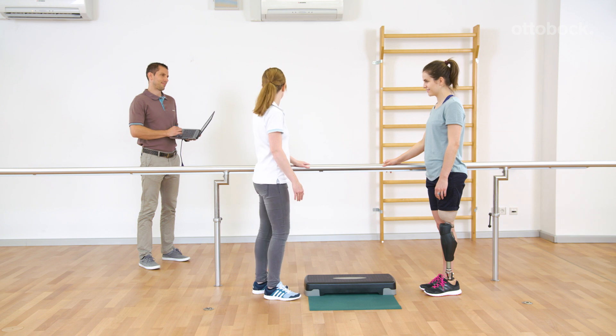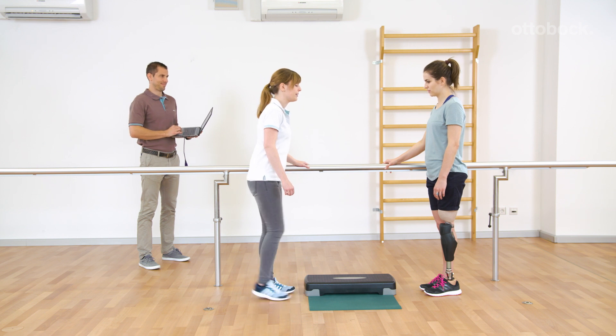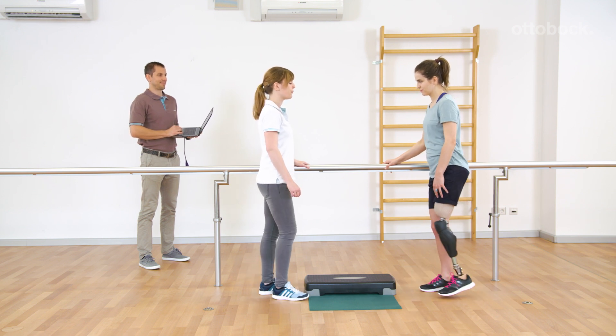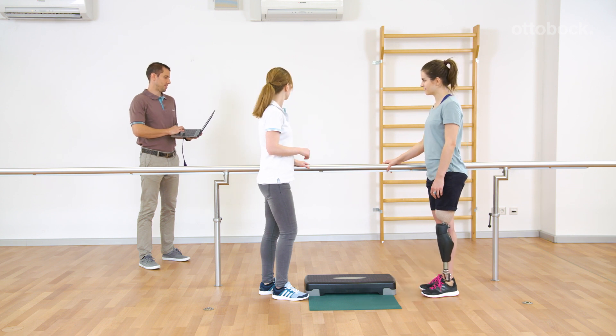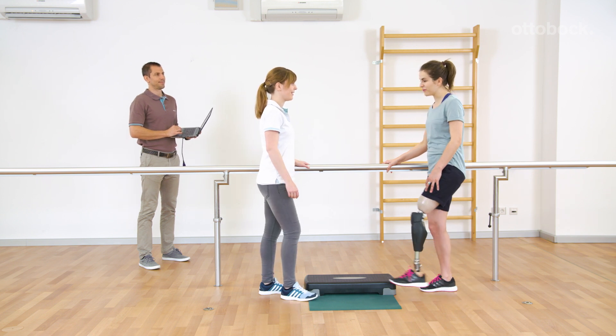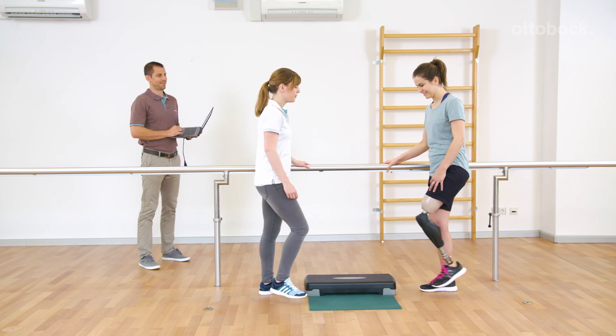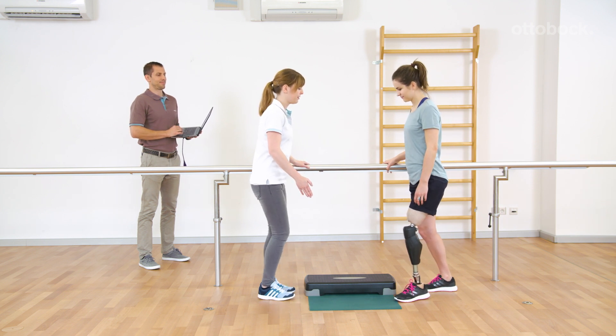Additionally, the stance flexion resistance can be adapted independently from the basic mode. If the resistance is high, the knee bends slowly if unloaded. If the resistance is low, the knee is completely free, as in cycling mode, if unloaded. The appropriate adjustment has to be defined individually with the user.